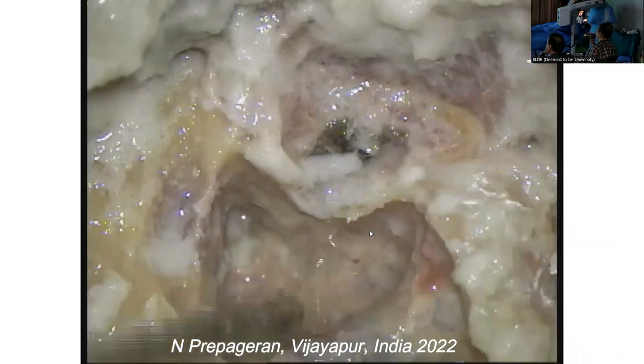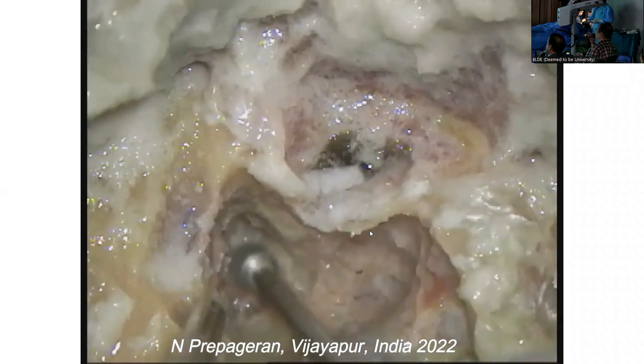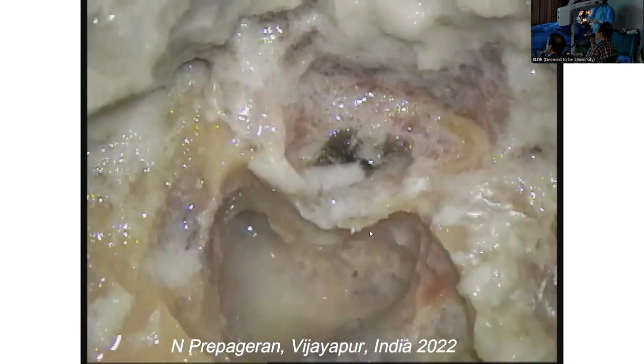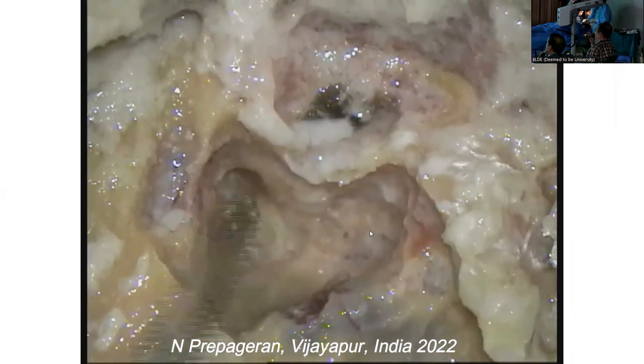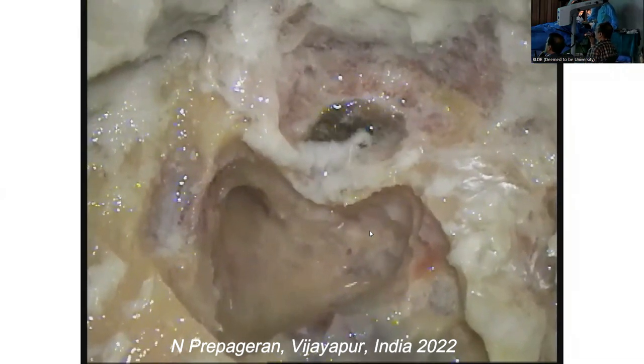For the sake of postgraduates, sir, if you are doing only a mastoid and not approaching the skull base, is it necessary that you expose the dura and sinus all the time? Depending on what you're doing. If you're doing a skull base exposure, the triangle of attack requires it. If you're doing a cortical mastoidectomy, then you don't need all that.